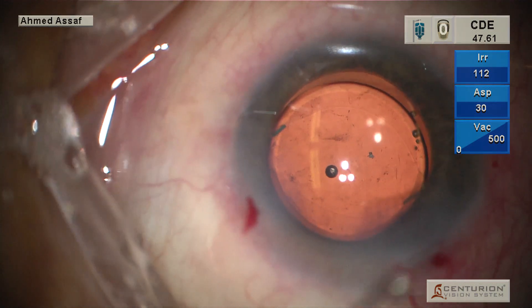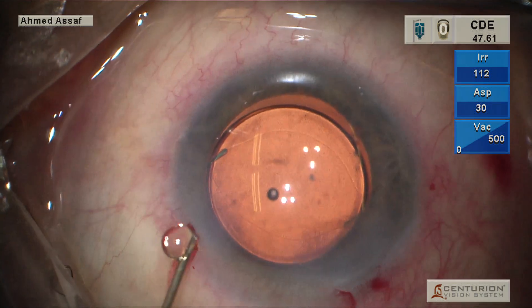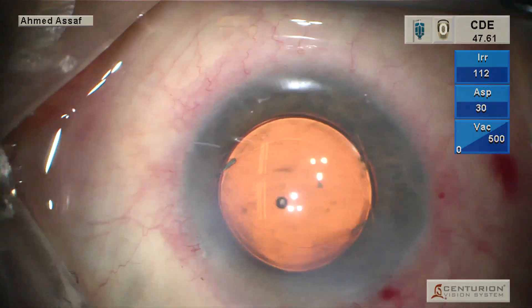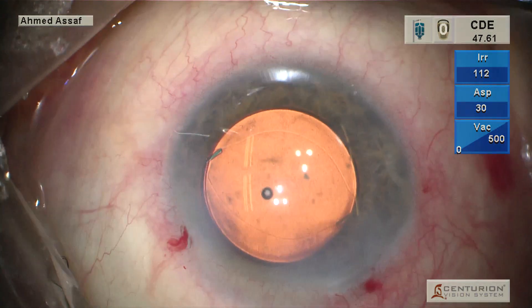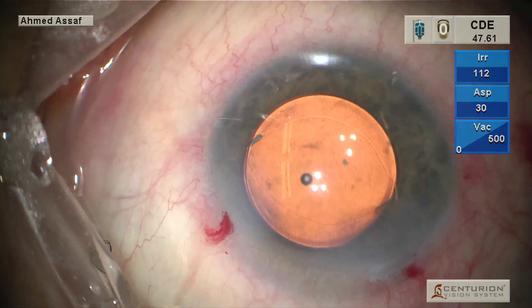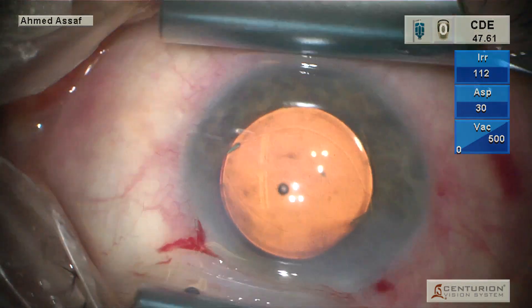Bigamox — this is a preservative-free moxifloxacin to be injected inside the eye. Just before conclusion of the surgery, the pressure is fine and the wounds are self-sealed. Thank you very much for watching.